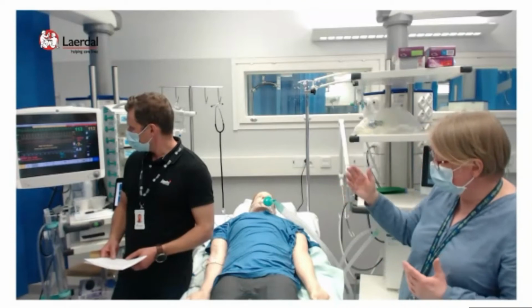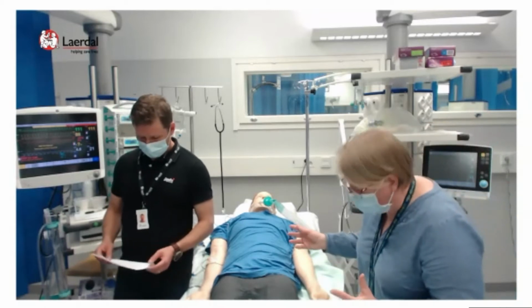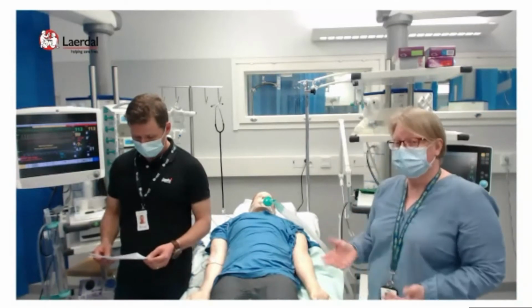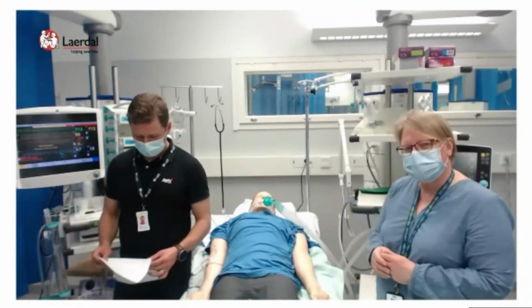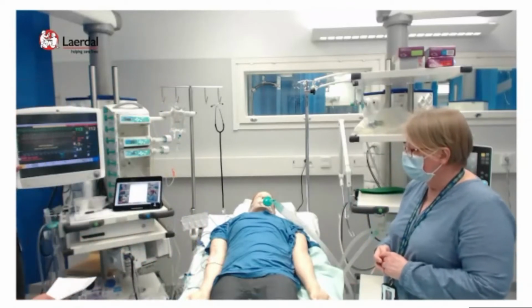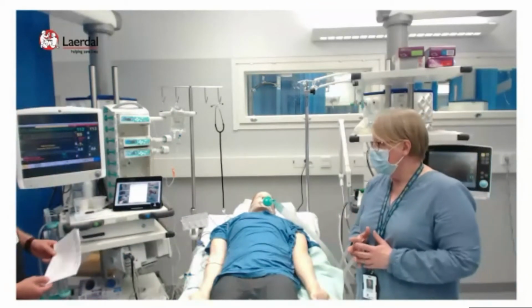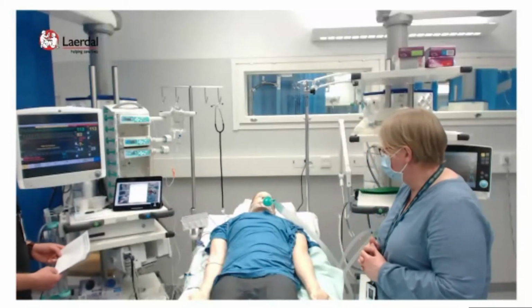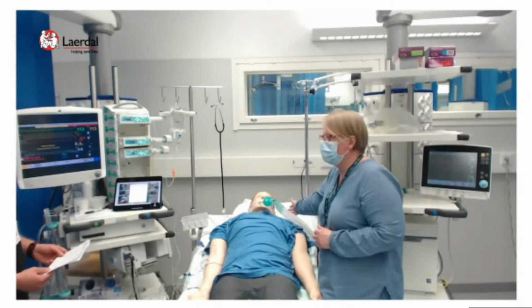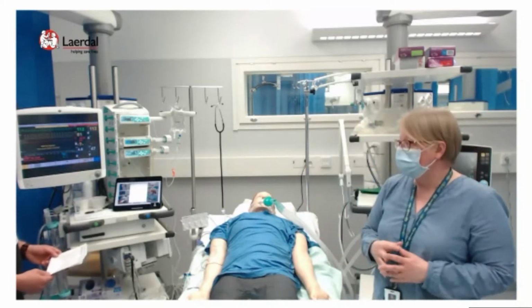Patient is sedated with propofol and fentanyl boluses, and it starts to wear off, and the patient starts to breathe more spontaneously. So he wakes a little bit up. So let's see what happens. I don't know if you can see the monitor really well. Yeah, the patient starts breathing, and maybe moving a little bit his head, like here. And the problem is that the saturation drops to 81, 82.